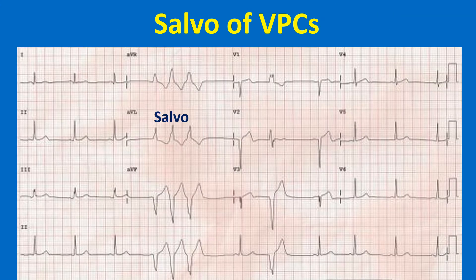The ECG shows a VPC salvo. The original meaning of the word salvo is a series of shots fired in rapid sequence from a gun or simultaneously from multiple guns. An isolated VPC is seen subsequently. QS complexes are seen in V1 to V3, suggesting a previous myocardial infarction.